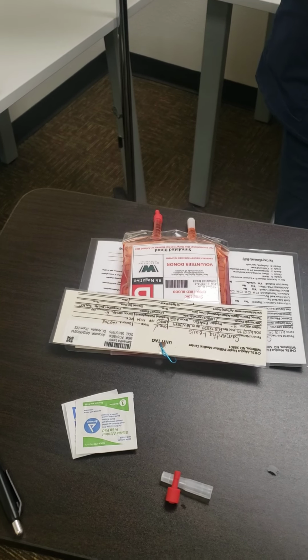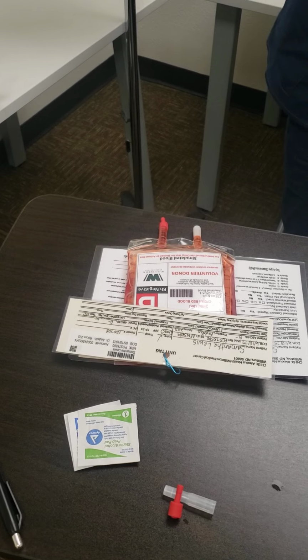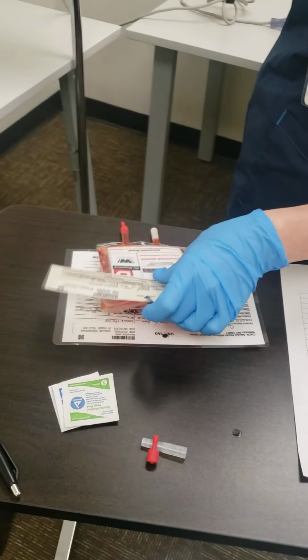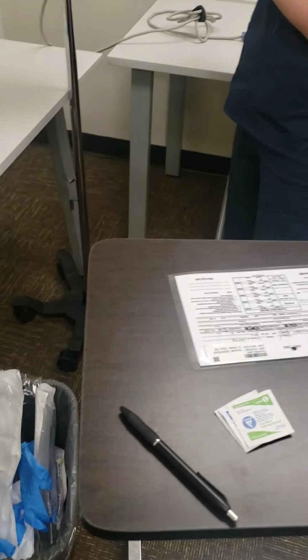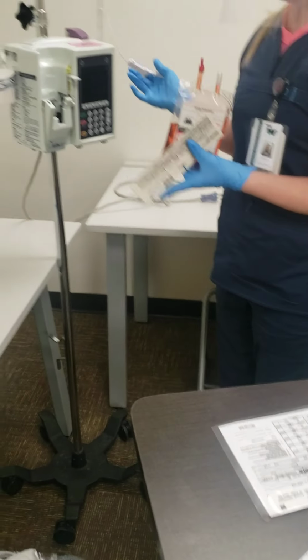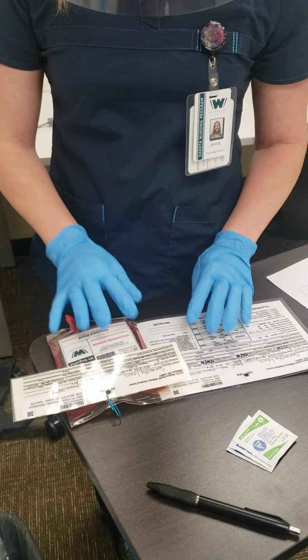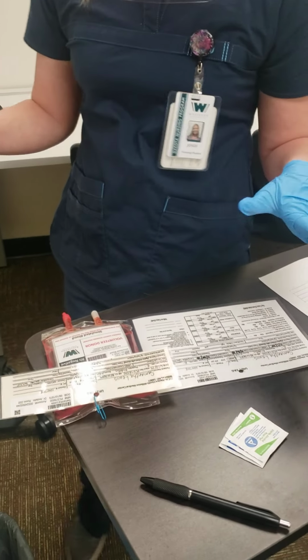So we know that the blood needs to be hung within 20 minutes after getting it from the blood bank. Oh yes, so before I do it, I'm going to do a third check by myself without the second nurse, just to verify and make sure that everything's in order.